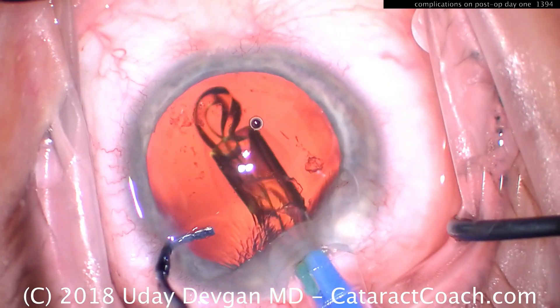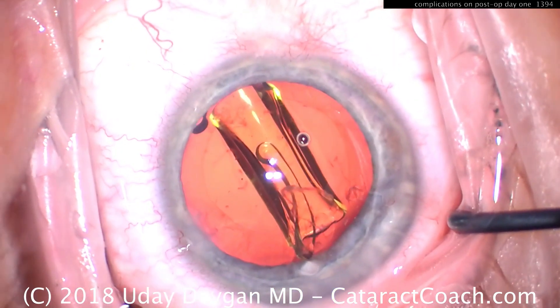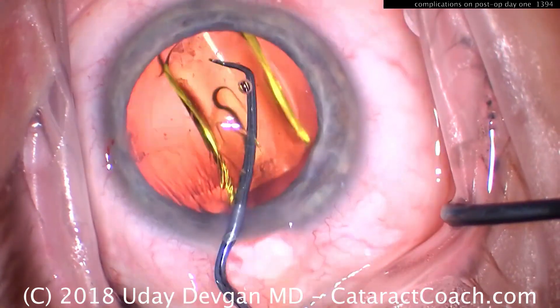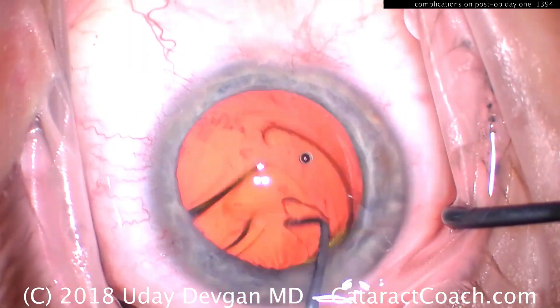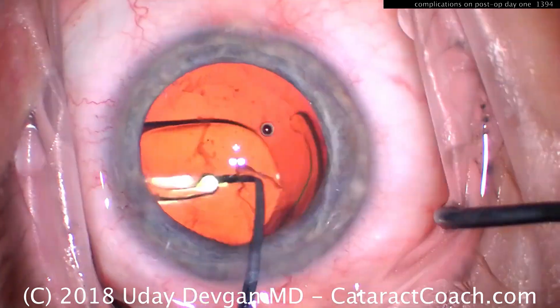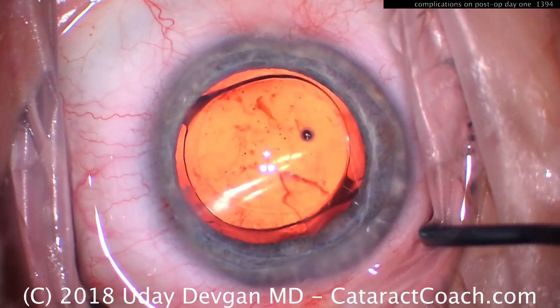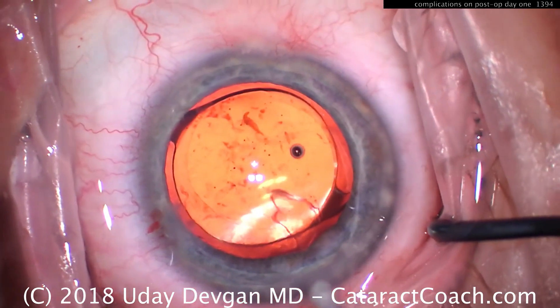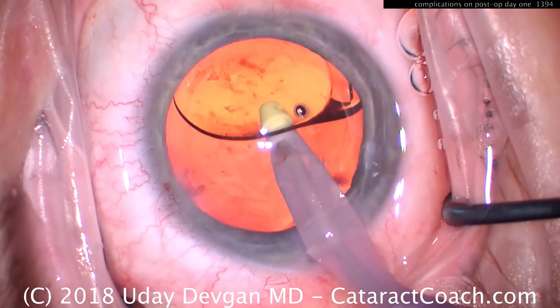Here at the end of the case, the lens is implanted and the rhexis is back — a routine case. We'll get that lens dialed in; the rhexis is back and everything looks pretty routine. We're going to wash out all the viscoelastic. Remember, especially if you're a very efficient surgeon — if this is a four, five, or six minute cataract surgery — you may not have run enough fluid through the eye to really remove viscoelastic.